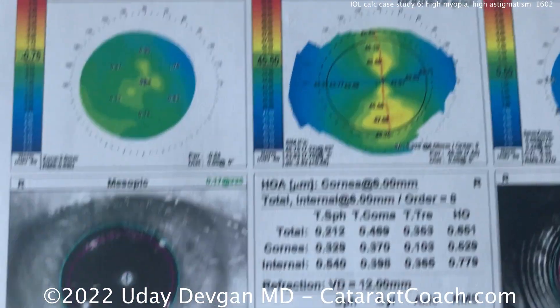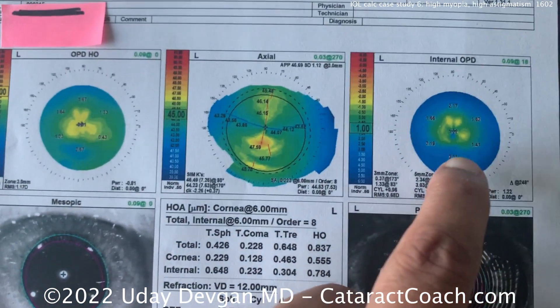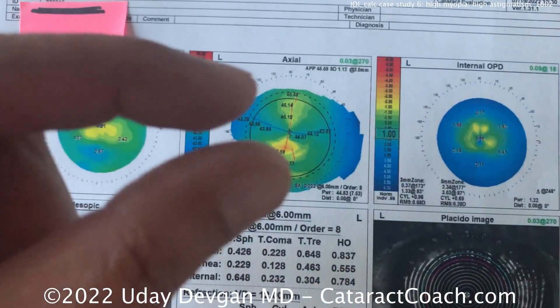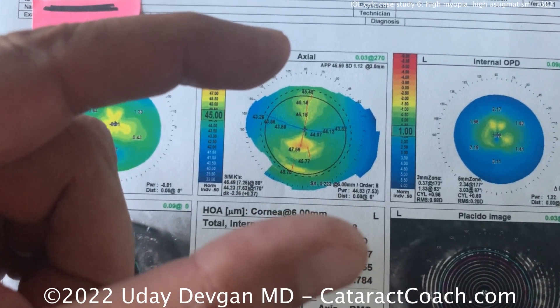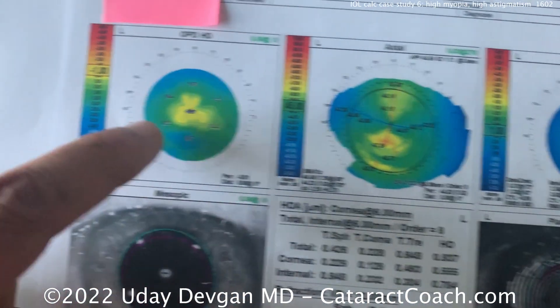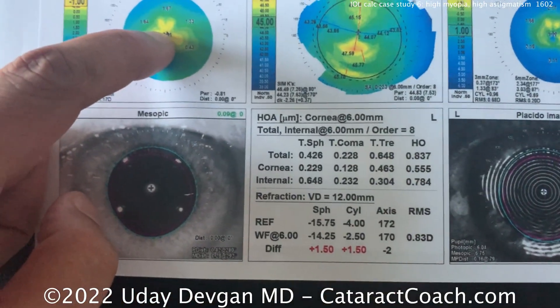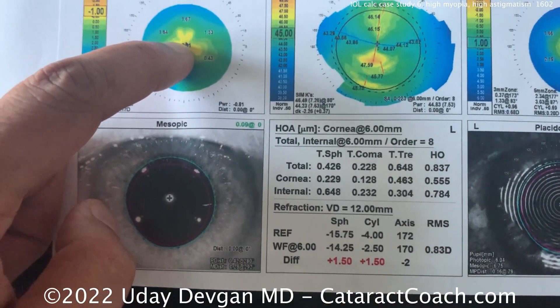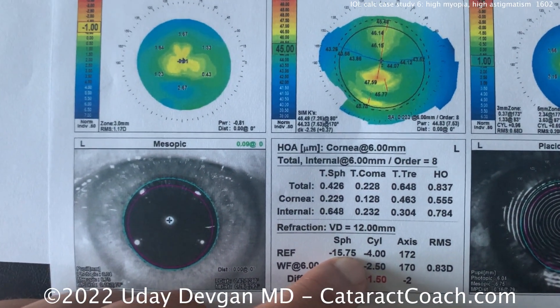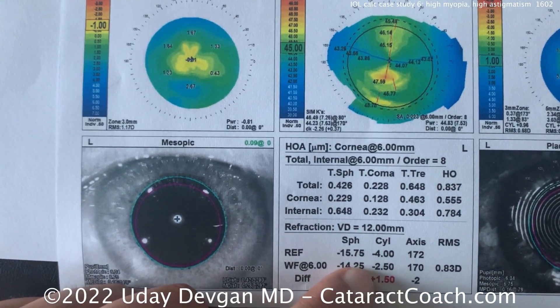That big myopic shift is from the central nuclear opalescence. We can see the telltale characteristics: if you look at the lens of the eye, there's increased power in the center of the lens; the lens thickness was increased to 5 millimeters AP distance; and on the total refraction, power is much greater in the center. That explains why the refraction in the center is higher than the refraction at a larger 6-millimeter optical zone.